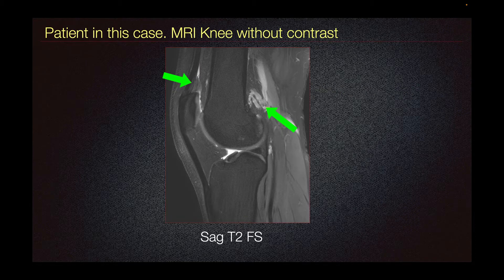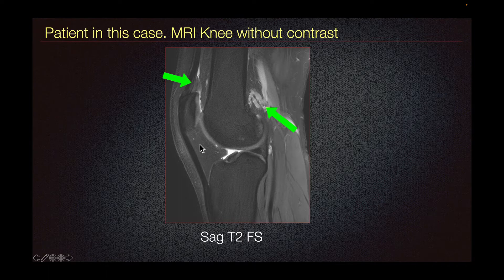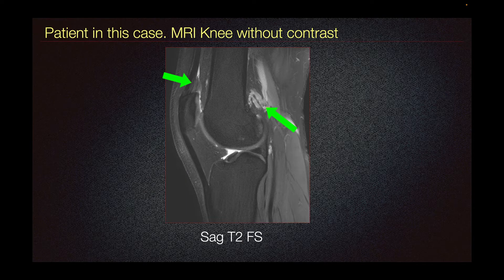The patient in this case presented with this MRI knee without contrast. We can see some mild edema signal of the quadriceps fat pad, and also this lobulated cystic lesion described as arising from the Baker's cyst, but it's not well depicted on this sagittal imaging. We also look for any signs of edema signal in the Hoffa's fat pad, or any large joint effusion, which the patient does not have, or any synovial thickening to assess for synovitis.